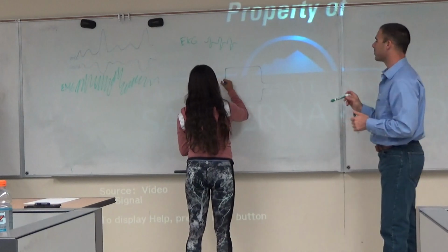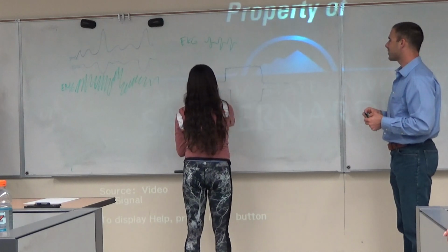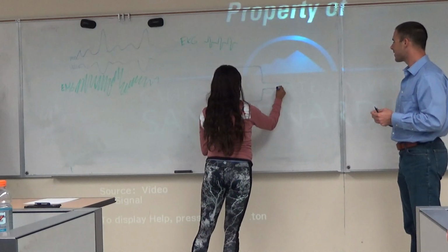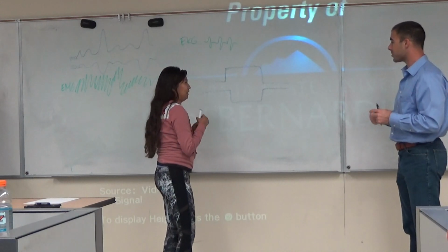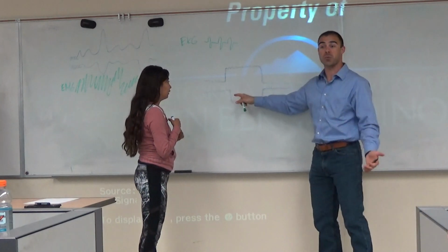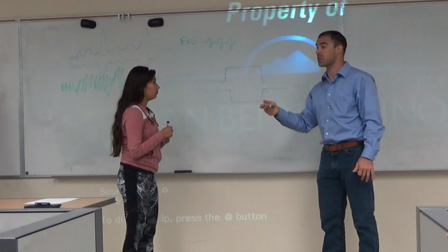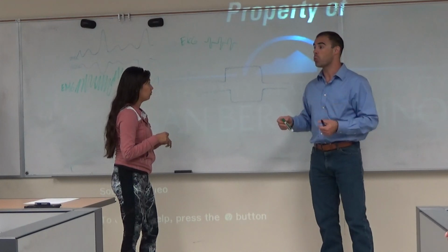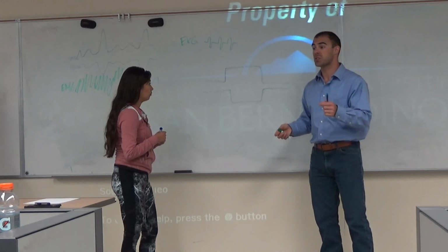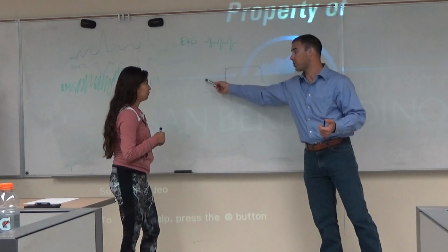Okay, so where are our labels going to be on that too? What sites are we looking at that activity for? Just like we labeled the links up there, we've got to label something like this, right? Because we still don't know. Maybe this is brain activity. It'd be pretty weird brain activity, wouldn't it? One of the ways I'm trying to get us to think about this is that when we look at these electrical traces, we can use a lot of clues to figure out what it means. One of the big clues is which site on the head it was recorded from, that is, location. That gives us a lot of insight. So what are the locations that we should label this from?